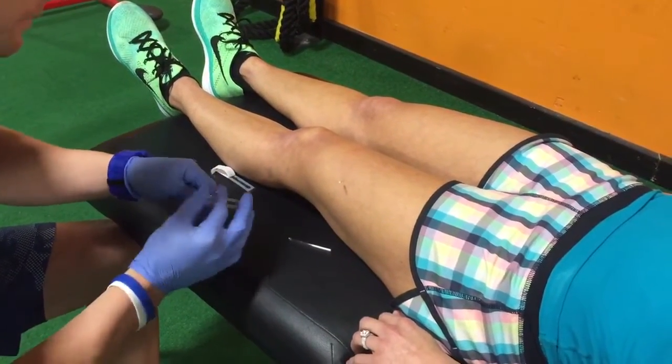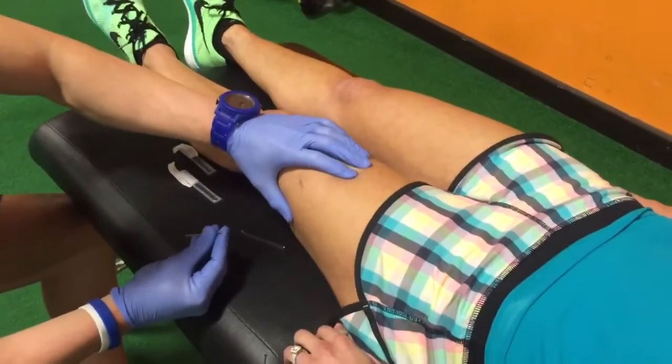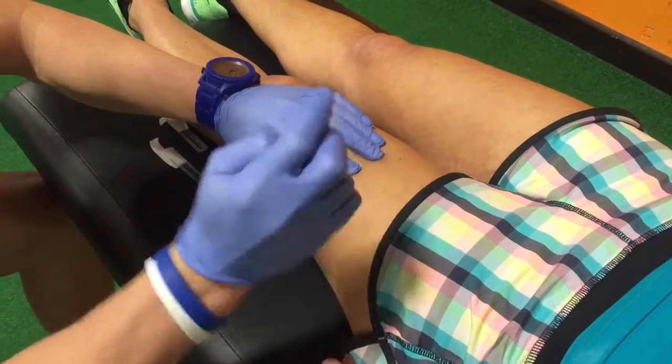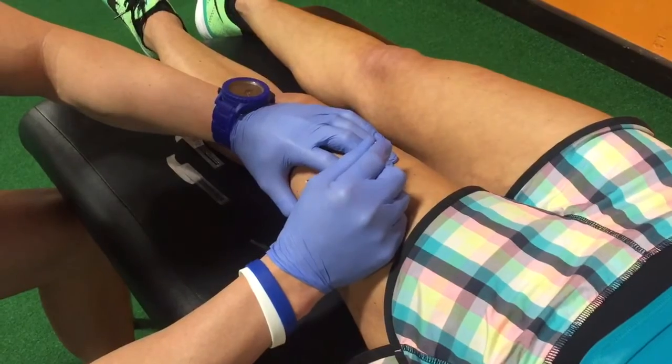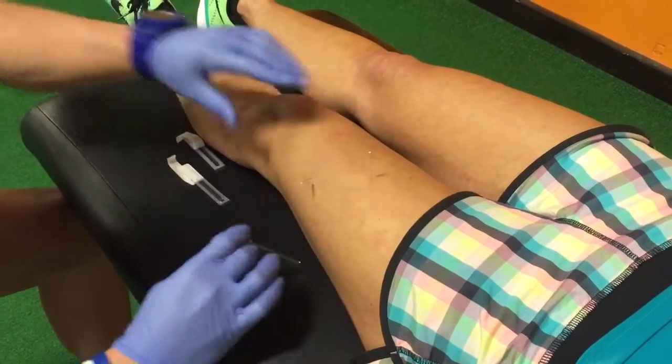The second muscle we're going to target is the rectus femoris that we just mentioned. It runs down the midline here. So we're going to find another tender point, get the needle in, drop down right on to the femur.